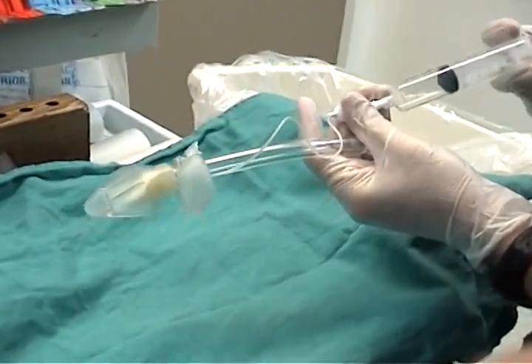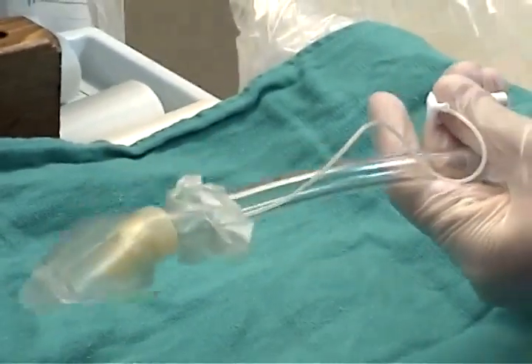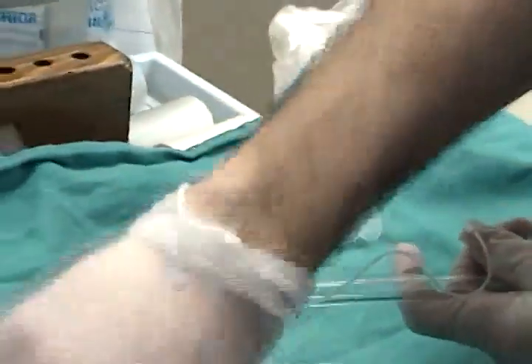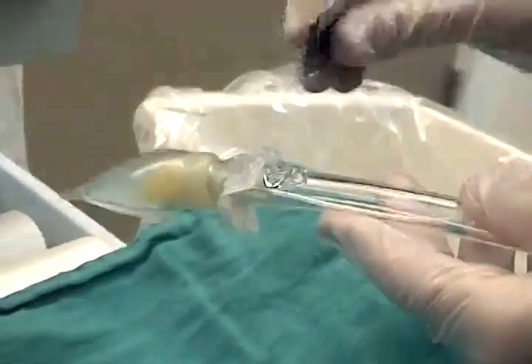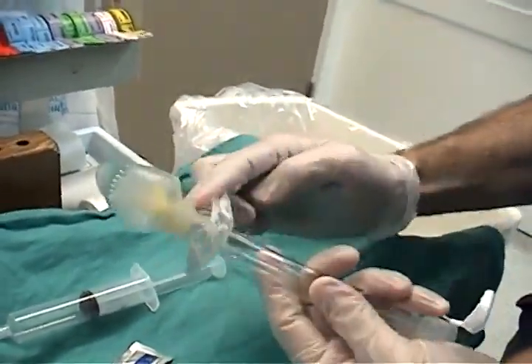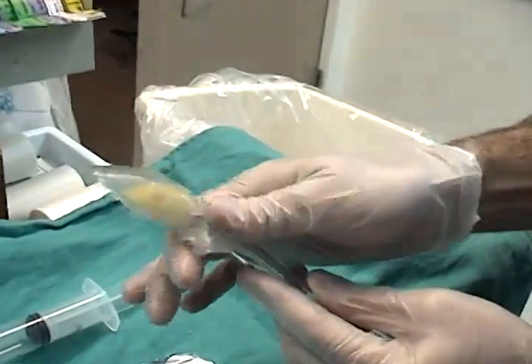The first step is to check the cuff. After checking the cuff, deflate the cuff completely. Then lubricate the airway generously. This includes the cuff itself, and the head of the Cobra PLA. Afterwards, pull the cuff down around the tube.